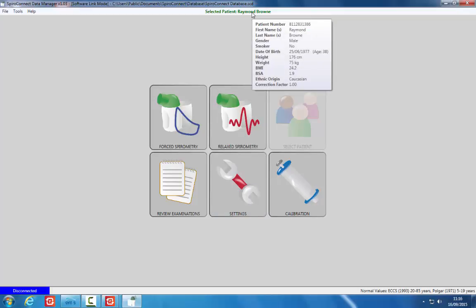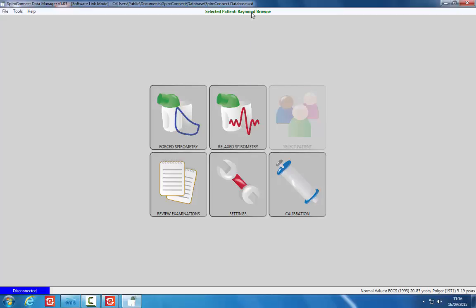For the purposes of this training, we will run through a relaxed, forced and post-bronchodilator test. Click the relaxed spirometry button.